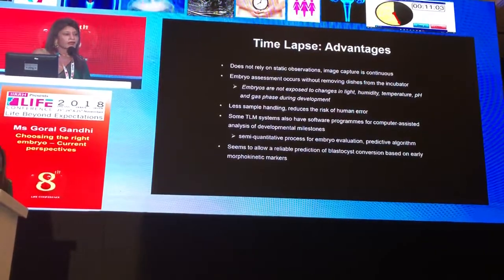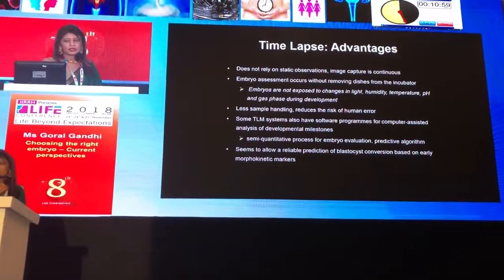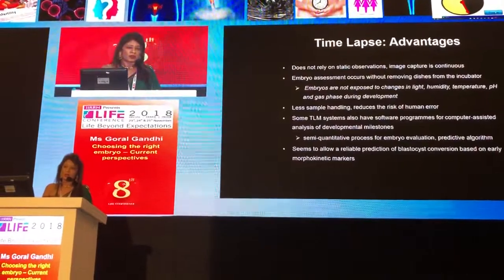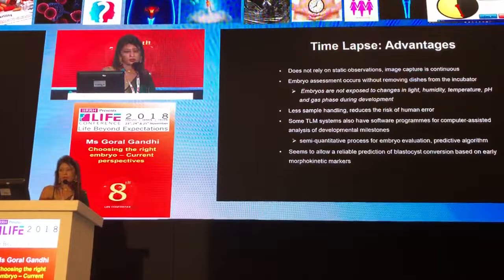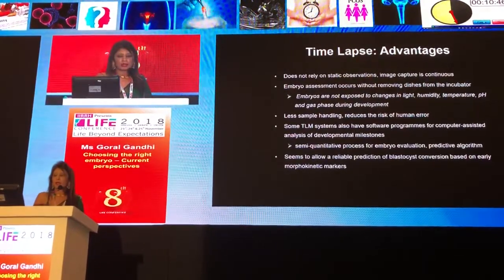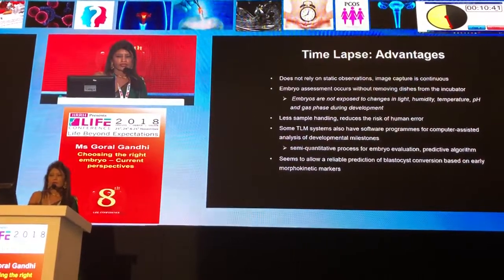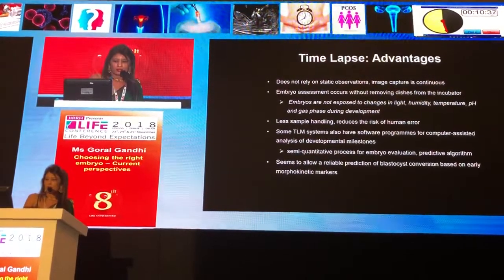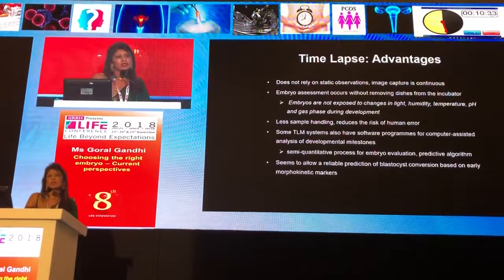So there are many advantages of time-lapse. It does not rely on static observations. The image capture is continuous. Another important advantage is that embryo assessment occurs without removing the dishes from the incubator. So embryos are not exposed to changes in the environment. So that adds to the quality of the embryos. There is less sample handling. It reduces the risk of human error. So these are some of the great advantages of the time-lapse system, and the time-lapse teaches us a lot.